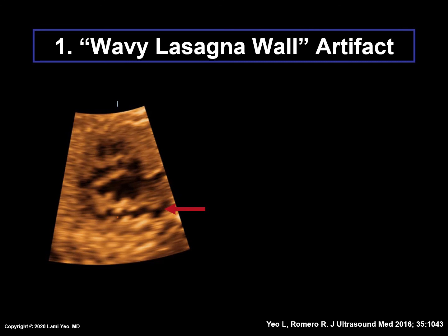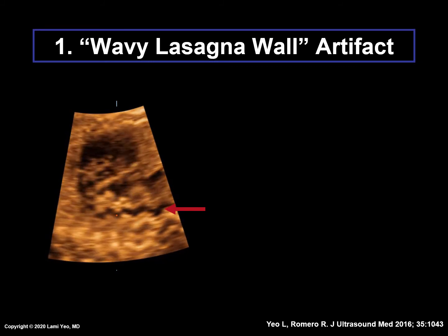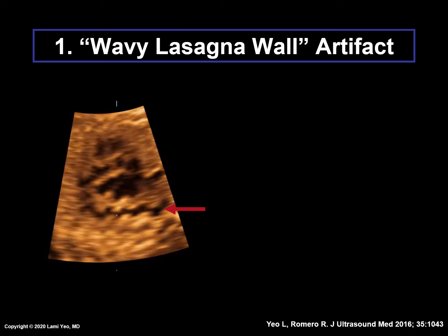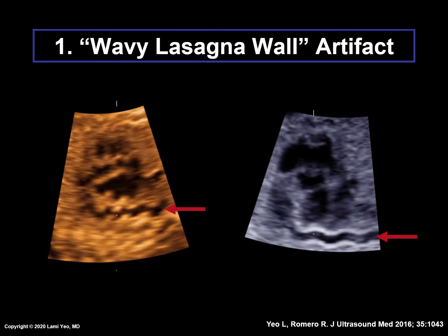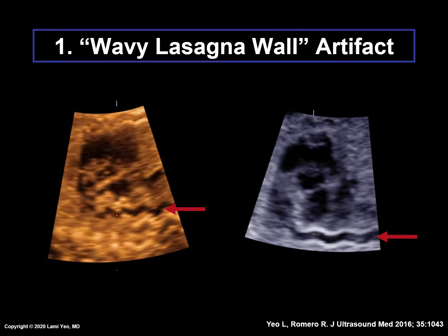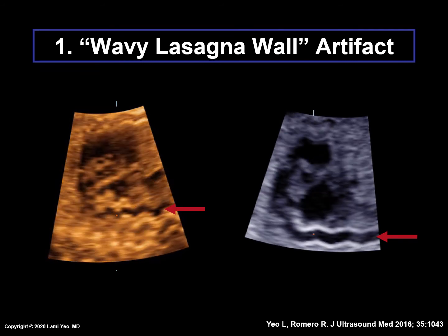Here are two more examples. For the fetus on the left, regular and intense fetal breathing throughout the stick volume acquisition has led to an uninterpretable and distorted sagittal plane. For the fetus on the right, there was also regular fetal breathing, but it was a slower rate of breathing and less intense. Thus, the wall of the longitudinal descending aorta is also wavy, but has a decreased number of waves, and they are flatter.